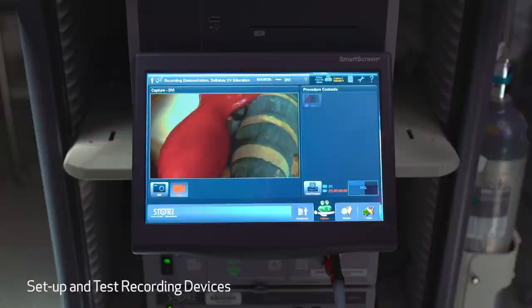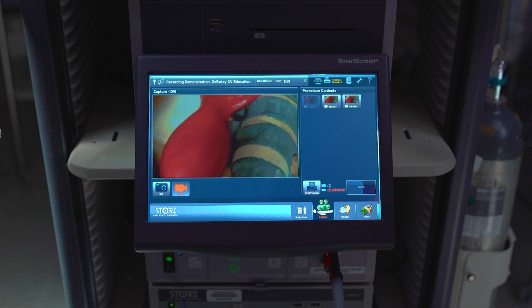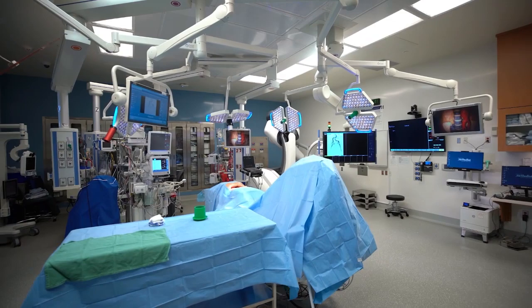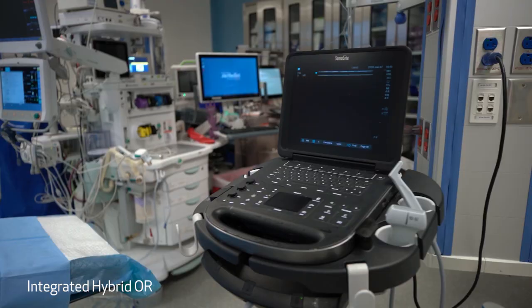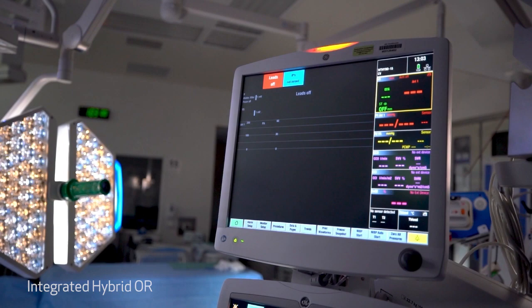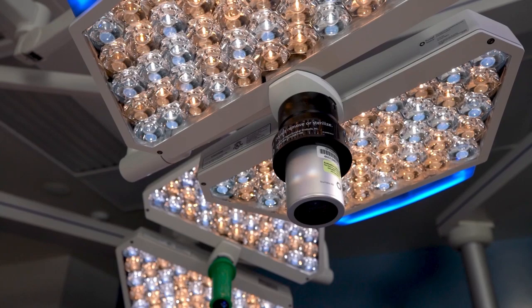You also need a recording device, and here is the recording device. In this case we have a Storz integrated room. We can either take pictures or we have two channels which we can record, and one of those channels can be split into four different screens. Here's an integrated hybrid operating room, which in the center of the field has an overhead camera. There are multiple inputs which can be utilized in these sophisticated integrated rooms — we can record ultrasound, physiologics, and endovascular procedures. This is an example of a high-definition overhead.